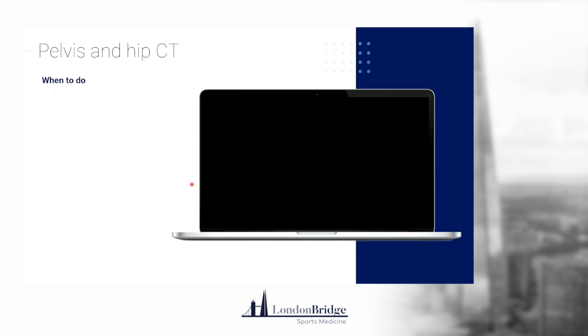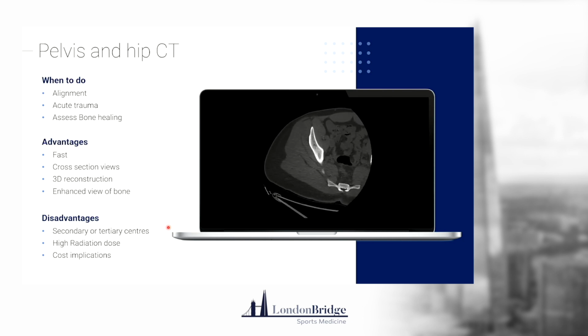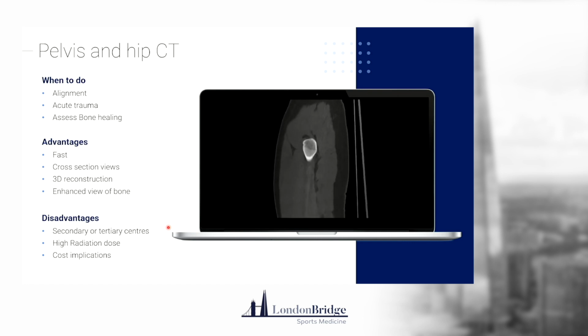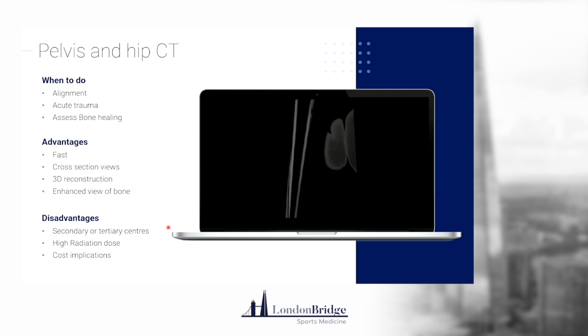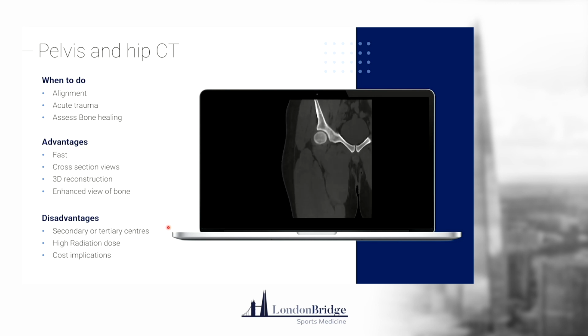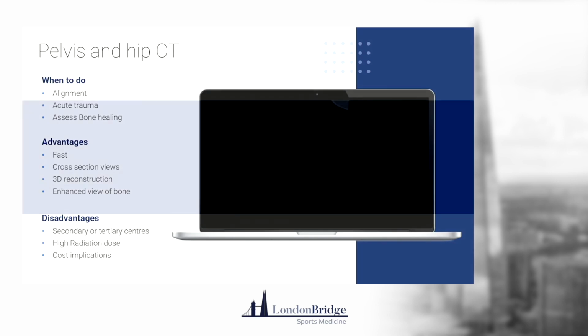So, CT. I think it's very useful when you're looking at alignment, acute trauma, when you want to try to assess bone healing. So that's a very useful function of CT. It's very fast. You can do like a trauma series in A&E. You can get 3D reconstructions as well. The main disadvantage is it's a high dose radiation, though you do get low dose CT scans available now. Again, it's really only accessible in secondary or tertiary centres.